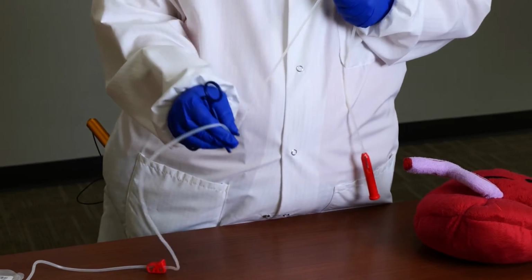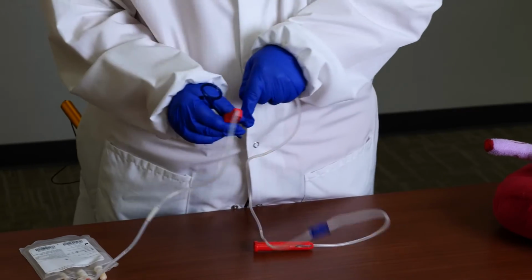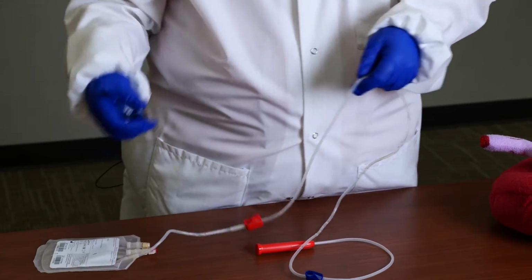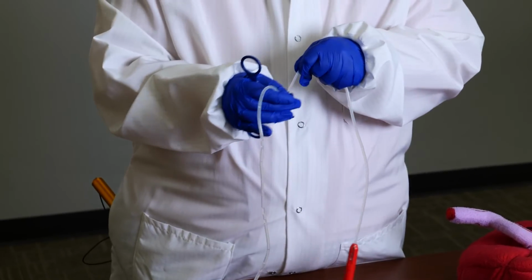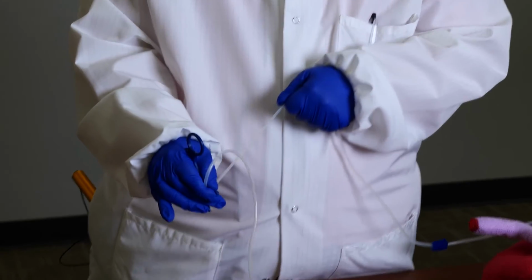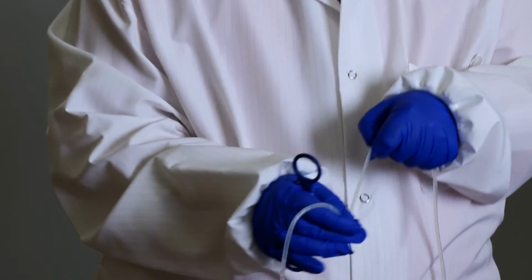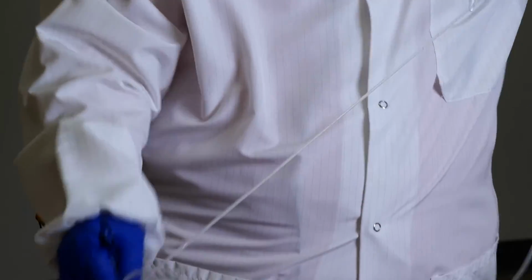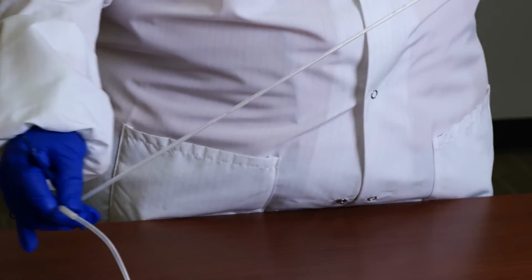ensure that all the cord blood gets into the bag. We recommend stripping the tubing twice to ensure that all the cells get out of the tubing and into the bag. We'll go ahead and do one final strip here. If you're not able to locate the hemostat to do this, you can use the attached blue clamp instead.